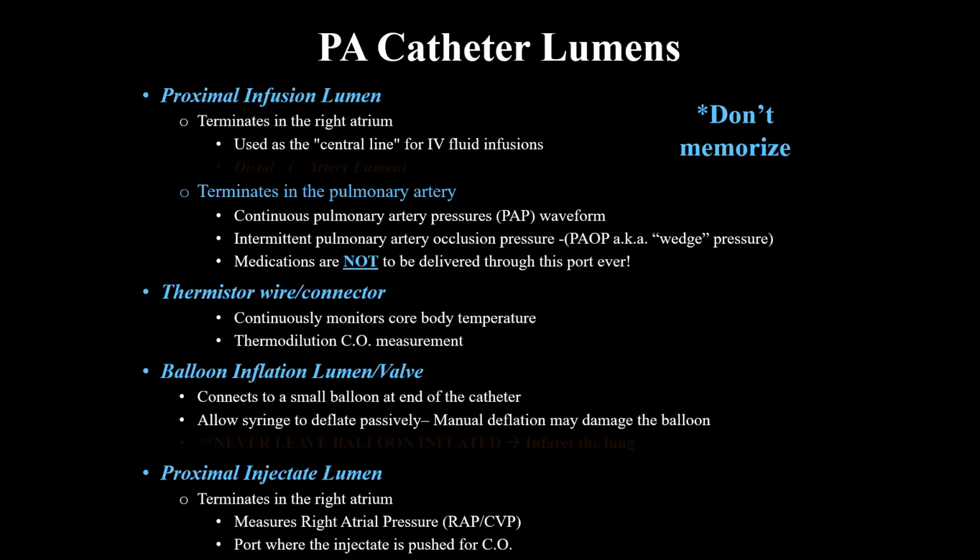And then the thermistor is where we connect to another cable that goes to the monitor, and it gives us a continuous core body temperature. We need to know the patient's body temperature to evaluate cardiac output, and I'll show you that in a minute.